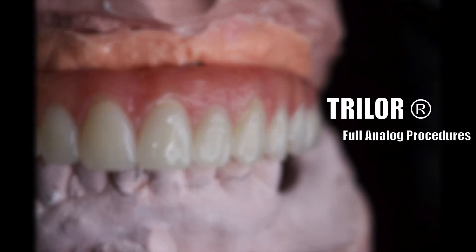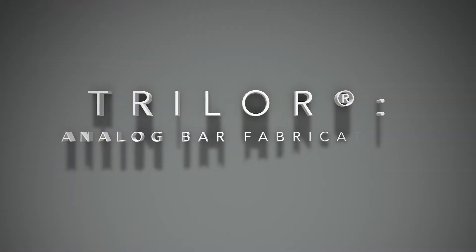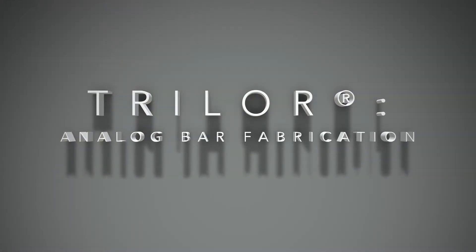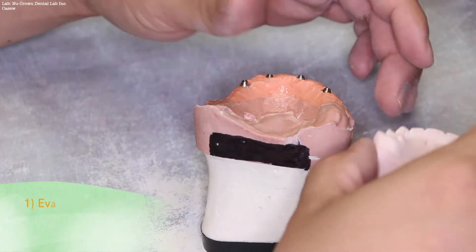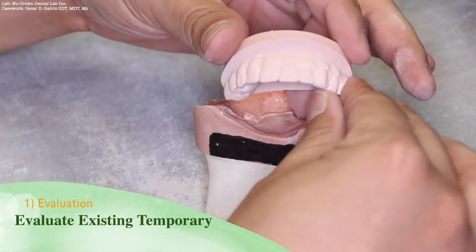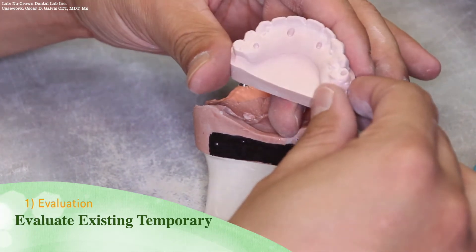Welcome to the Analog Procedure Instructional Video for Trilor, a High-Performance Polymer. This instructional video will make use of Trilor as a substructure for all on X cases.